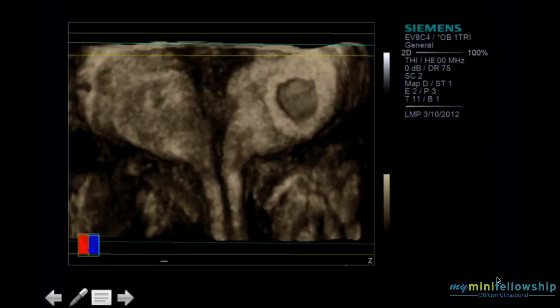And you can certainly identify circumstances, as in this case, the one we're looking at, where you can see with certainty that this is a uterus didelphys with a large decidual cast in the non-gravid horn. And here we can see one of the sacs. I think that's the sac without the embryo. Quite an elegant depiction of what's going on.